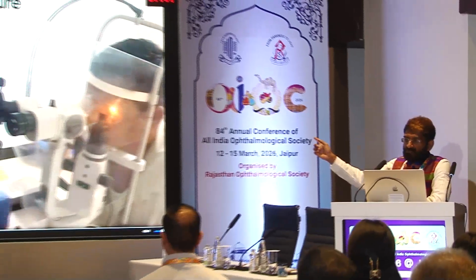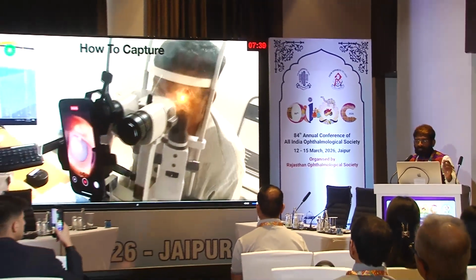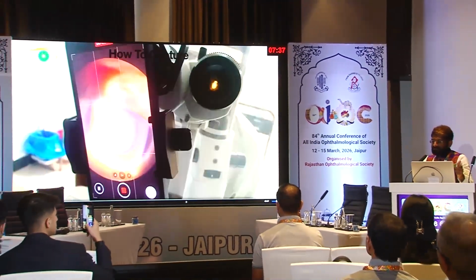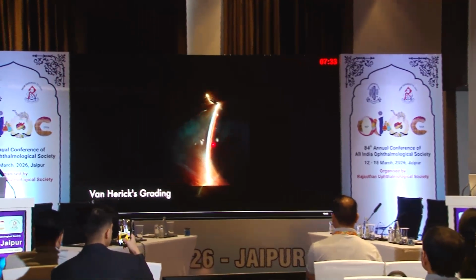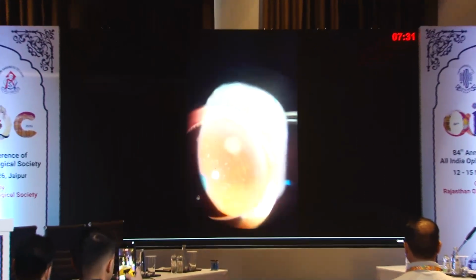I'm going to share a similar take from my good friend Dr. Atul. Anterior segment imaging. How I started is, I always believed in videos. Videos gave more scope, and I used the simple adapter which Dr. John Davis taught me, and I started using an iPhone to take all anterior segment images. And at one point in time, we were also one of the first to record the AIOC PA.